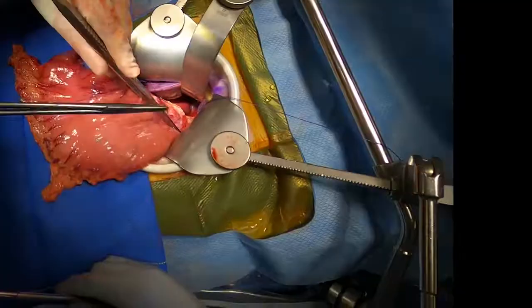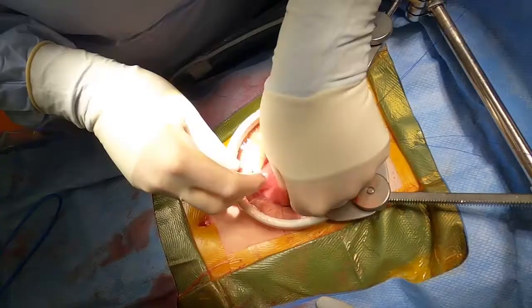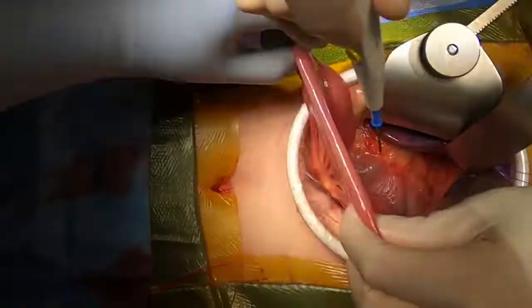First, the esophagus is tagged with 3-0 PDS. The point of division is about 1 cm above the GE junction. After successful division of the esophagus, the gastric specimen is taken off the field with a proximal margin marked and sent to pathology for frozen section.